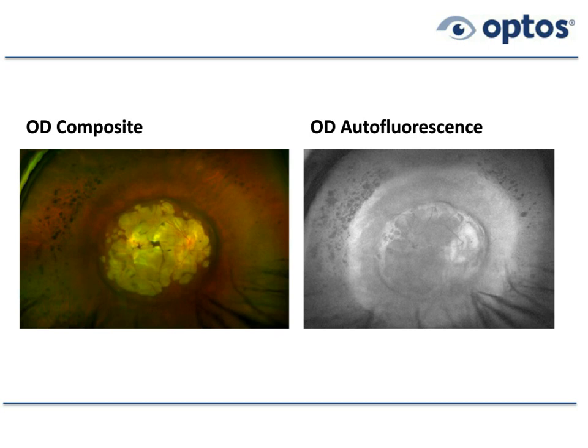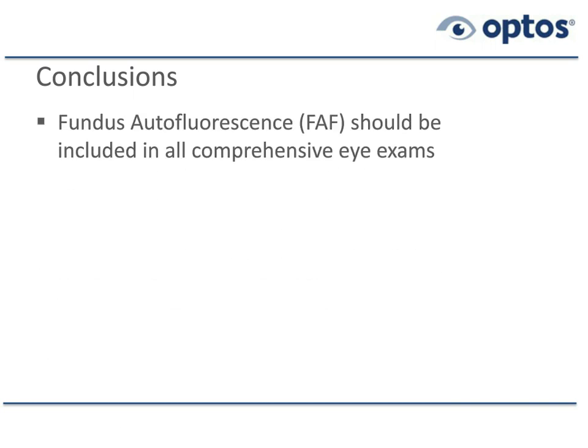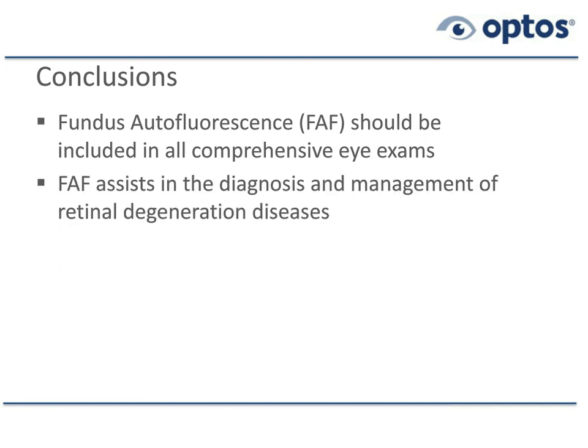And I guess we're getting close to the end of this, so let's make some comments about conclusions. Okay, we've covered 15 cases. I would have preferred covering 50, but perhaps at a different time. Fundus autofluorescence should be included in all comprehensive eye exams. The technology is available. The technology is remarkably useful to pick up things that we might miss, and it certainly assists us in the diagnosis and management of a whole series of retinal and choroidal diseases indirectly, if you will.